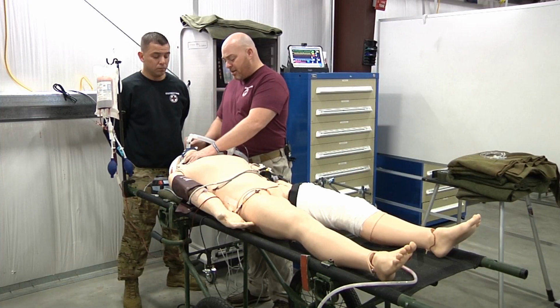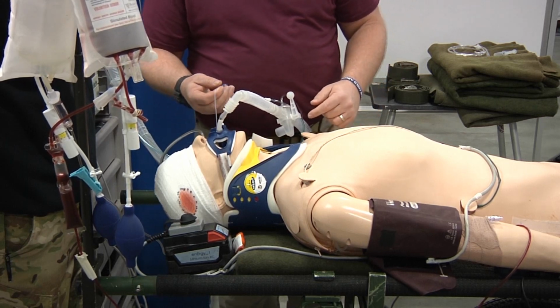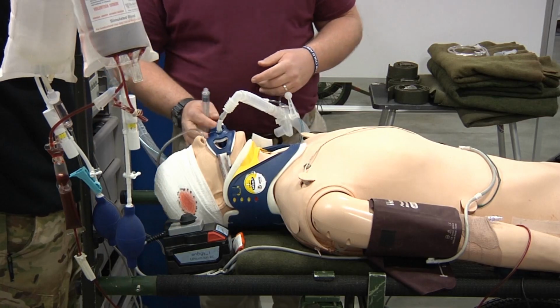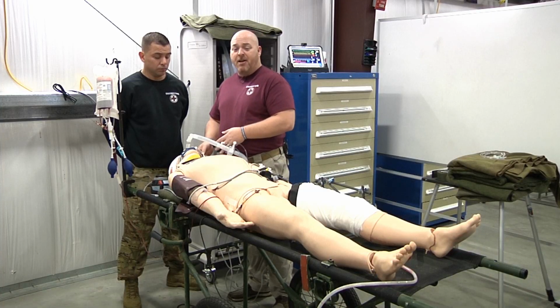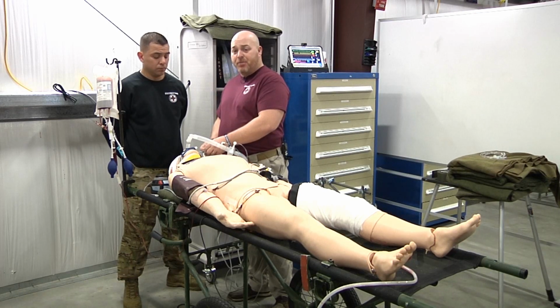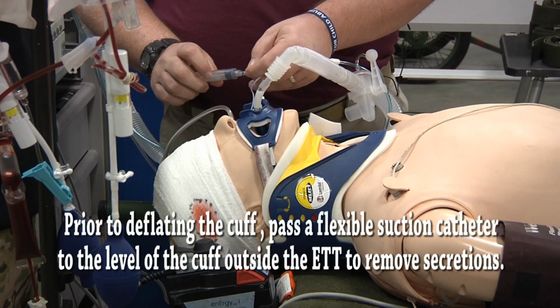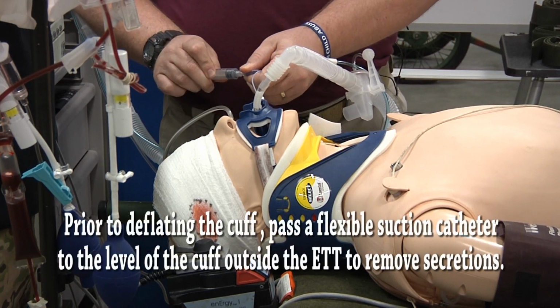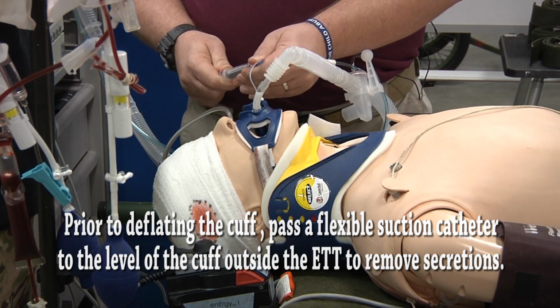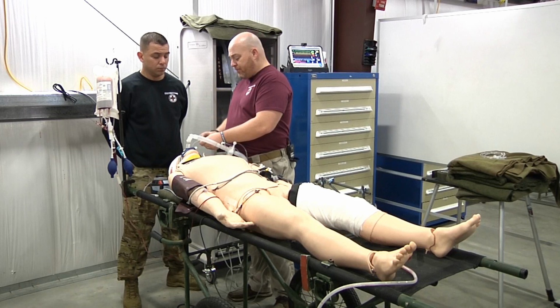After placing the C-collar, we can move on to the ET tube cuff, all right? So what we wanna do is the ET tube cuff, we wanna ensure that we check for pressure. Now, if you have the appropriate tool to check or measure pressure, that is the recommended guideline. If you do not, then a technique is you can take a 10 cc syringe, you can back out all of the air out of the cuff. You're going to get a low pressure alarm, all right?